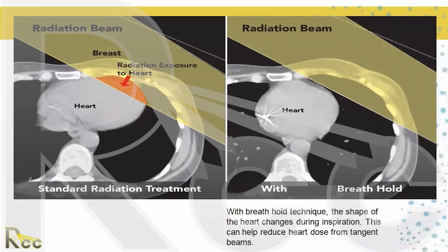It had to be shaped with cerrobend blocks. I remember many times having to pour these cerrobend blocks that protected the spinal cord with lateral opposed fields. But the dose coverage with linear accelerators, intensity modulated radiotherapy, shaped field, is much better than with cobalt.